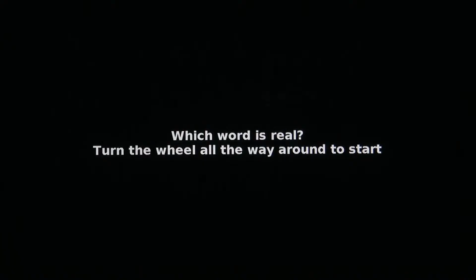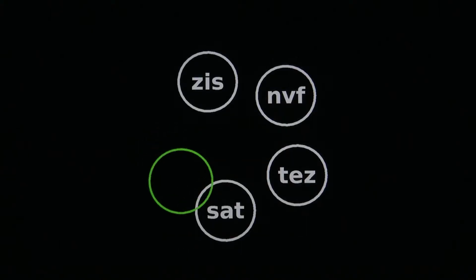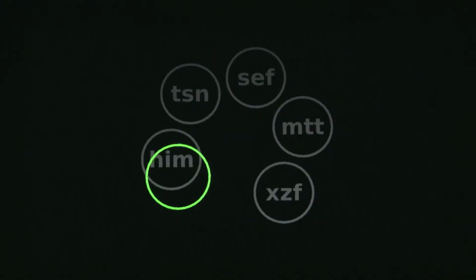Now we are going to be testing the same thing, but instead of letters, it is words. This is testing your word discrimination abilities. As you answer these correctly, the test will get harder by pulling out specks on the screen to make it more difficult for you to decipher.